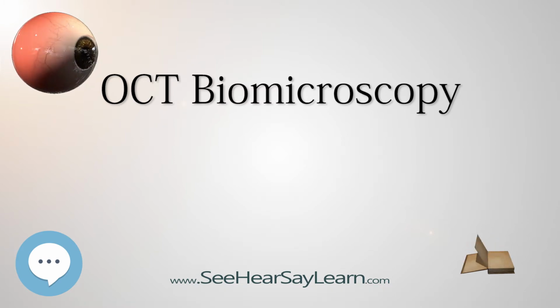Despite their relative ubiquity, slit lamps have several important limitations. As optical instruments, conventional slit-lamp biomicroscopes do not natively record or document exam findings in the way that imaging devices, such as OCT, MRI, or CT, do by storing images. Some modern slit lamps now have the ability to record 2D video or still digital images during an exam. Without any objective record of the exam, findings from slit-lamp exams are transient and must be interpreted in real time by a trained observer.